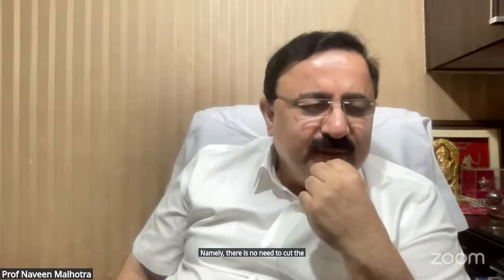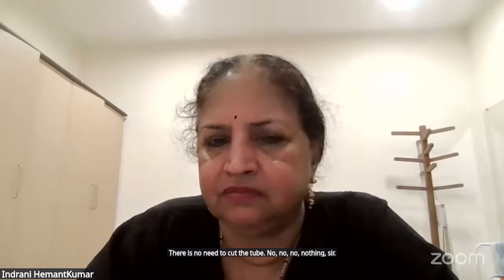Sir, is it necessary to cut the tube in length after submandibular excision, when we bring out the tube? Is there any need to decrease the length? No, there is no need to cut the tube. He's saying, should we have to cut the tube in the air? No, nothing, sir. Absolutely no need.